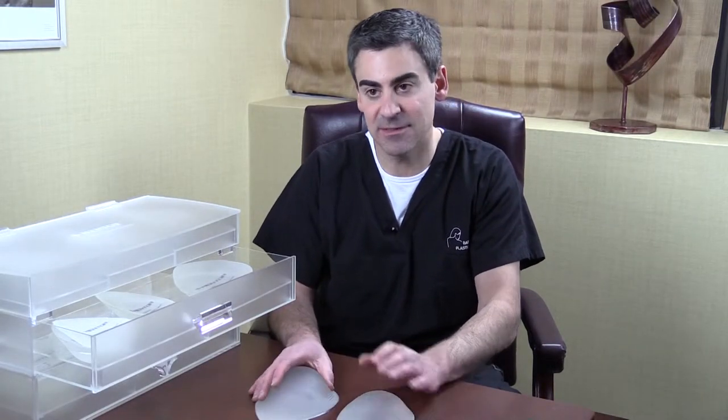One of the ways that we help determine the best implant size for you is we want you to actually try the implants on — I think that's the best way to do it. It's good to look at some before and after pictures, but it's a little bit difficult to see what it would look like actually on your body.